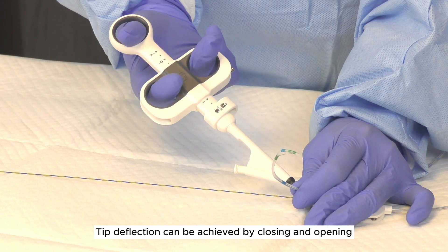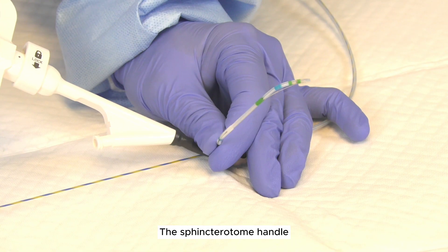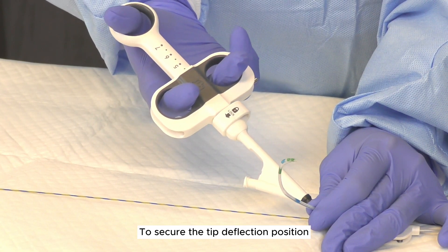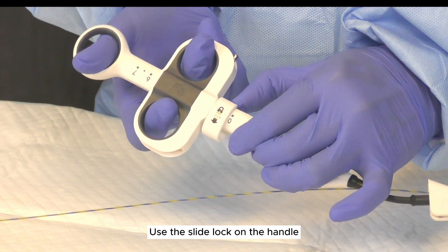Tip deflection can be achieved by closing and opening the sphincteratome handle. Tip deflection greater than 90 degrees is not recommended. To secure the tip deflection position, use the slide lock on the handle.